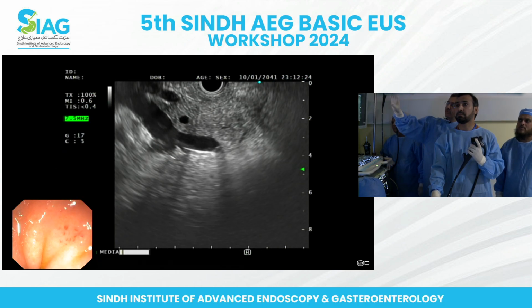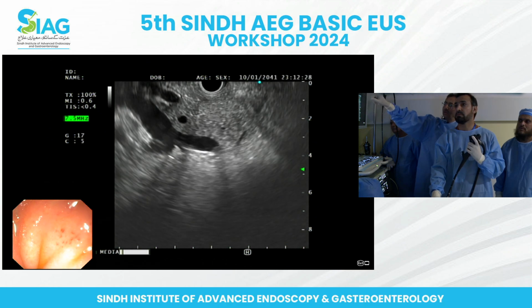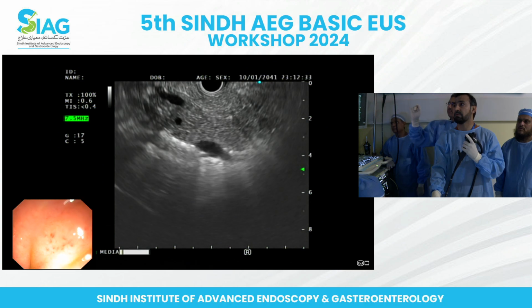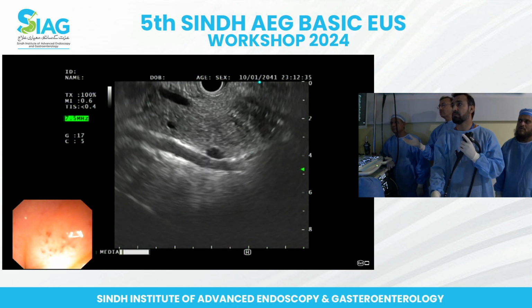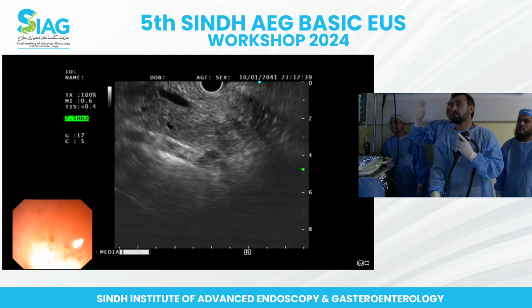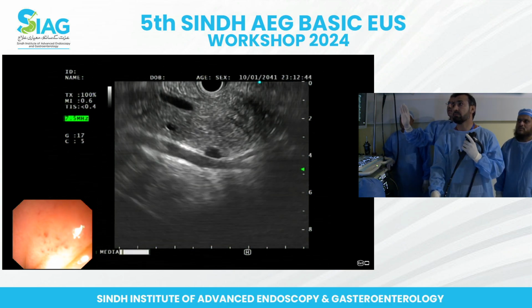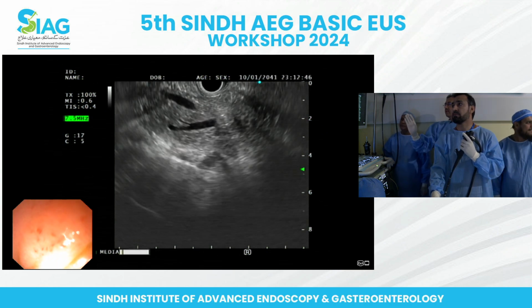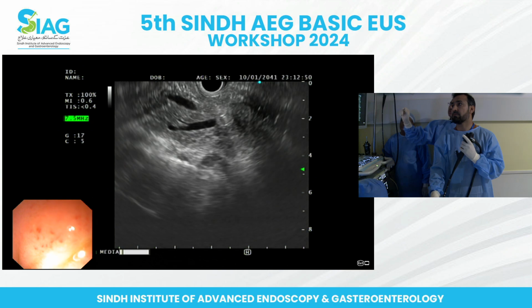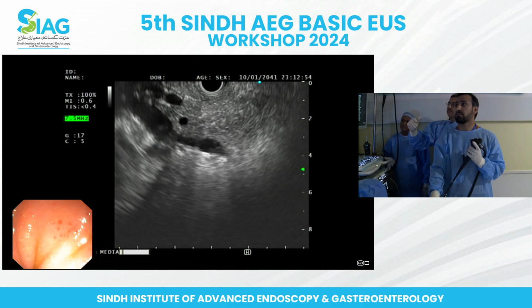Right. Now, you have seen the portal vein, you have seen the splenomesenteric vein. You need to switch your attention to the pancreatic duct. Now, pancreatic duct under your transducer, go to the right, go to the left. Yes, very good. Now, you're concentrating on the pancreatic duct. So concentrate on the pancreatic duct alone. Forget about all the other ducts. So trace the pancreatic duct to the neck and trace the pancreatic duct towards the ampulla.